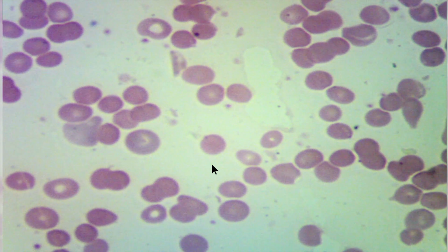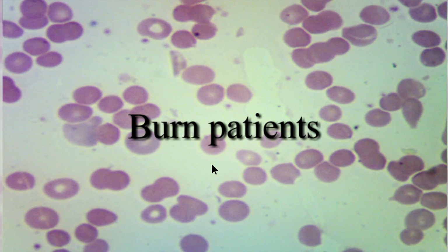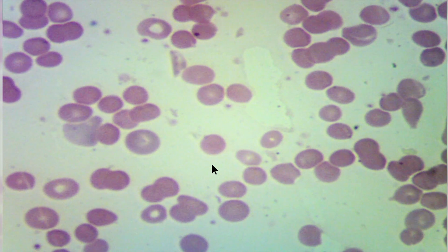Also, you can see spherocytes in severe cases of burn. And in those cases of burn, you will have a lot of schistocytes in the smear as well. Schistocytes and spherocytes are commonly seen within 24 to 48 hours after severe burn, and they will be removed as long as the spleen is intact and healthy. They will be removed very quickly from the circulation, so they are often seen immediately after the incident.